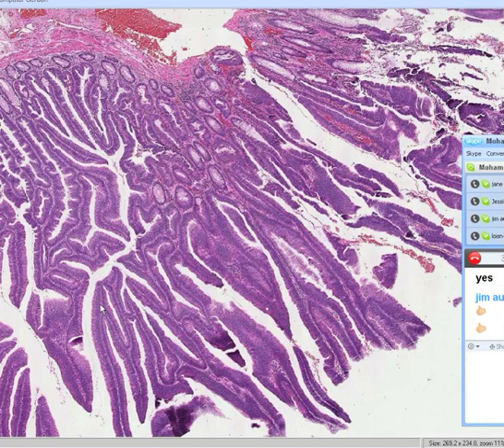Remember we said that villi are papillae. They are little nests of fibrovascular fibrous tissue surrounded by epithelial cells. So this is a proliferation of the colonic mucosa in which the glands are growing like grass rather than like little tubules.